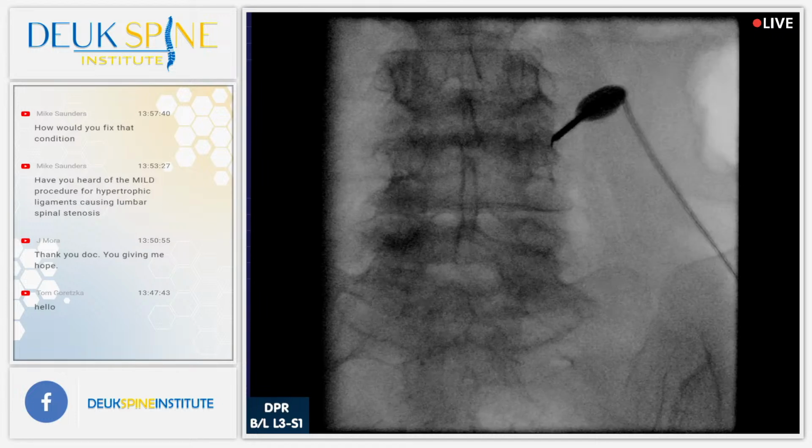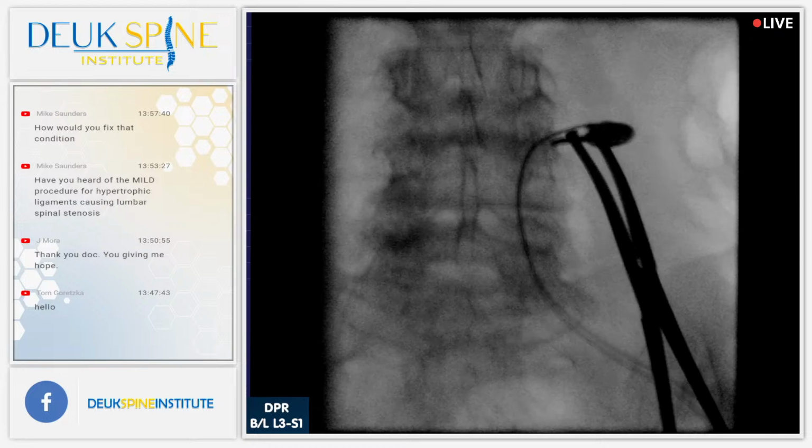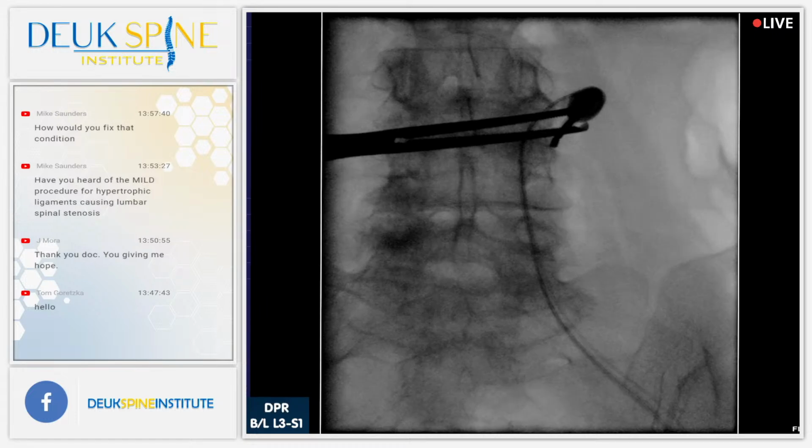Shot? No. Oh, the last one. We are on the second to last one. Everybody's anatomy is different, but I can feel the probe slipping off of her spinous process, her transverse process. No, it's not because she's moving, it's just her anatomy. Shot? It's a pain in the ass to see. Shot.